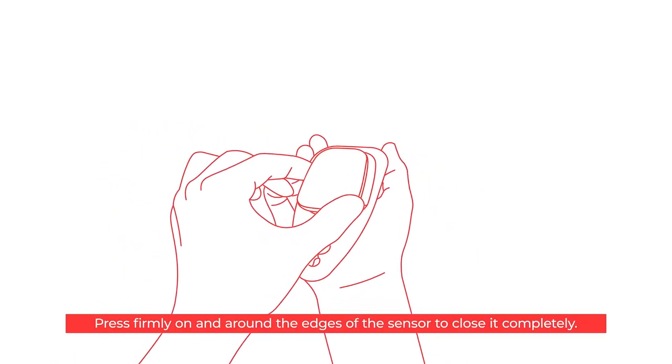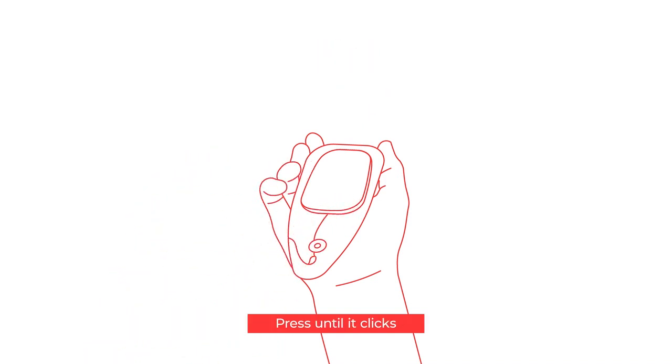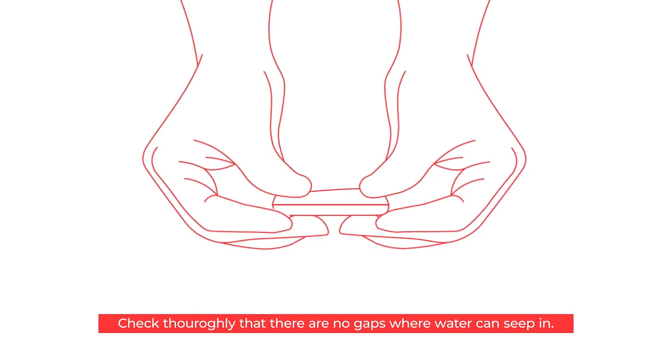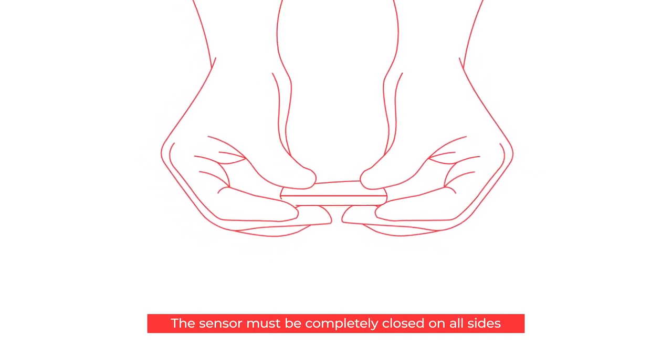Press firmly on and around the edges of the sensor to close it completely. Press until it clicks. Check thoroughly that there are no gaps where water can seep in. The sensor must be completely closed on all sides.